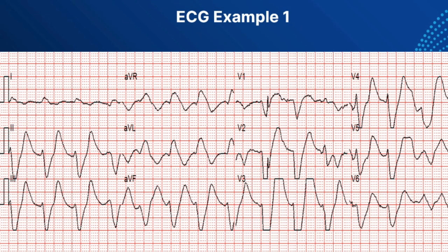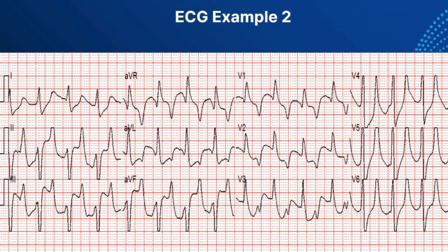ECG Case 2 shows how hyper-K mimics a STEMI. You can see peaked T-waves in some of the precordial leads, but for the most part it looks like an inferior STEMI — leads II, III, and aVF are elevated while lead I and aVL are depressed. But when you think the words 'wide and bizarre,' think hyperkalemia. This doesn't look like your normal STEMI — you can see where the T-wave was peaked and peaked and peaked.